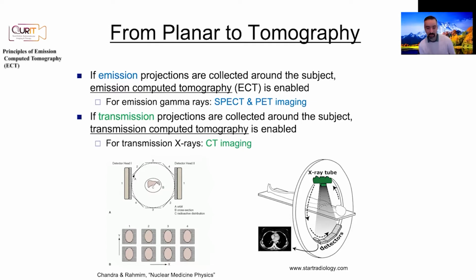But the source doesn't have to be X-rays. If you're working in the optical domain, where your wave is not X-rays but, say, optical or infrared, then you could be doing diffuse optical tomography when the source is outside the body, or if it's inside, it's like fluorescence molecular tomography and things like that, which we're not talking about at all.